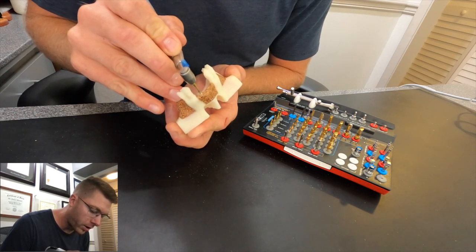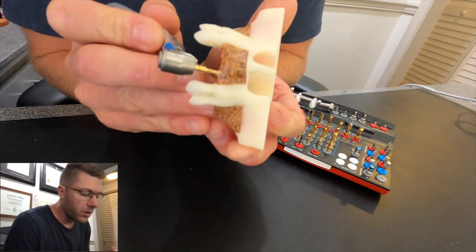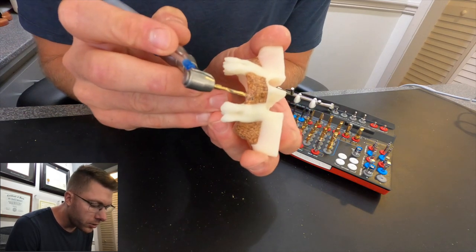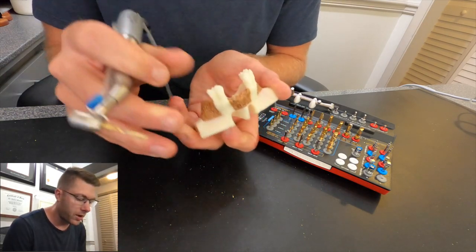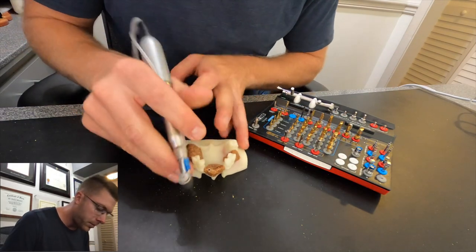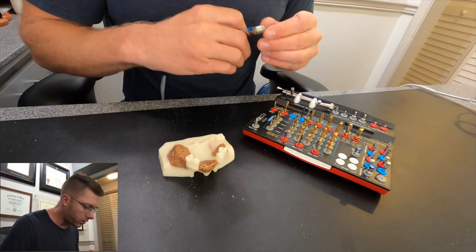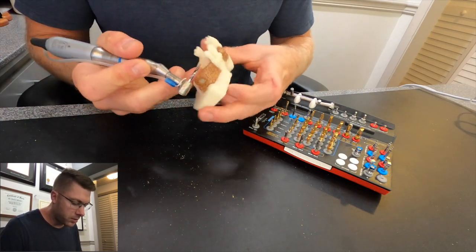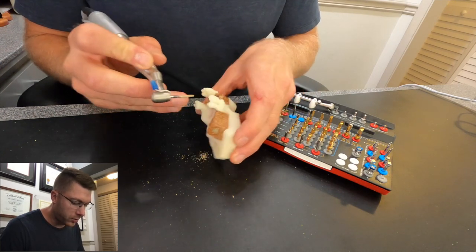Now keep in mind, there would normally be water running at the same time. You can see the burr goes exactly to the top of that dark mark — that way I know I am at the correct depth. Now we're going to go from our 2.0 to our 2.5 millimeter drill and go to depth. There's going to be a lot of water going on and suctioning to keep the heat down and to keep the debris being removed from the bone away from the site so I can see better.